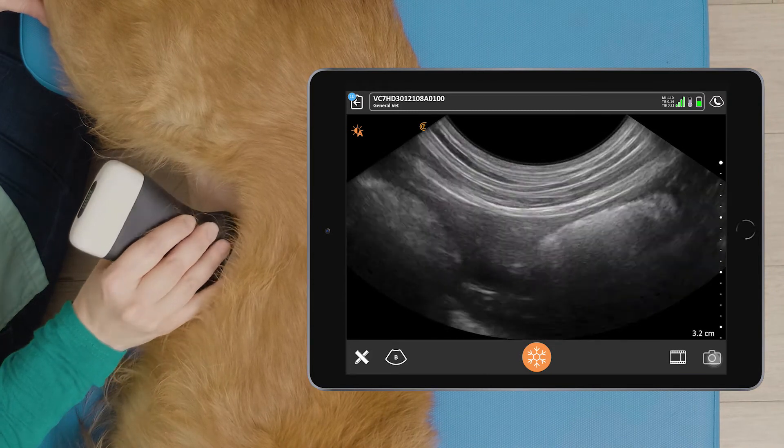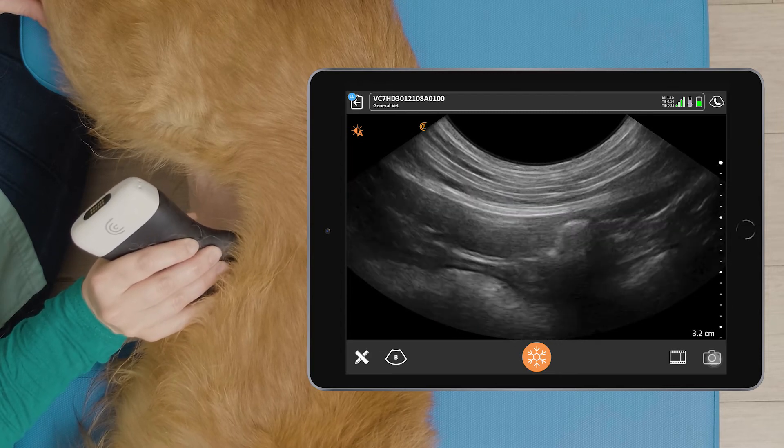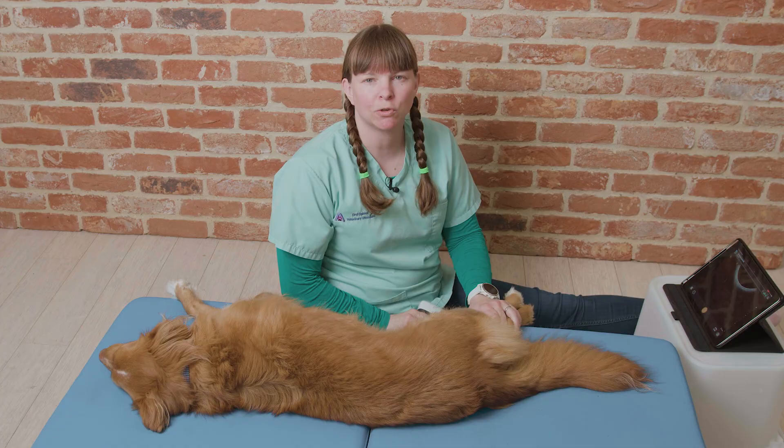We can also get a transverse view if we rotate the probe 90 degrees. We can see the transverse view at the top of the screen there. And that's how to scan the duodenum of a dog.